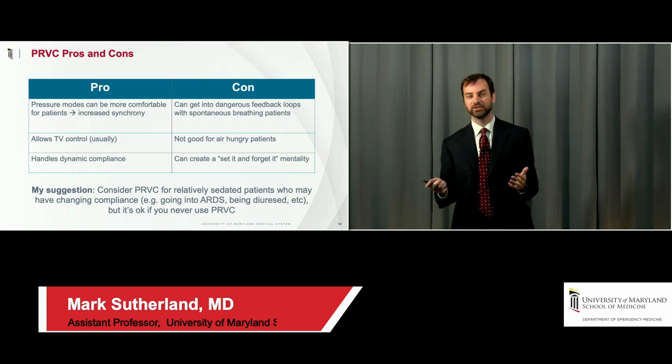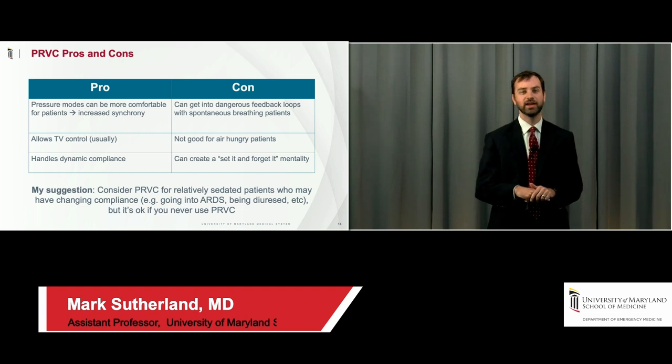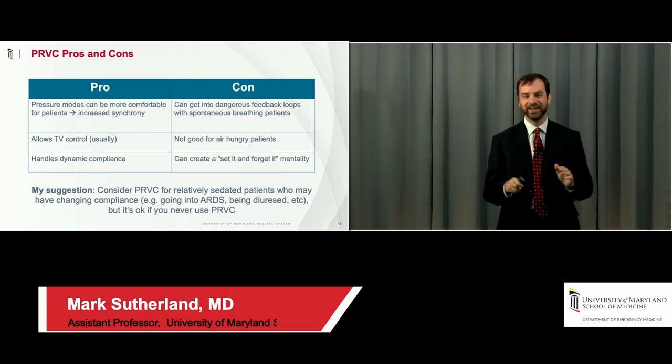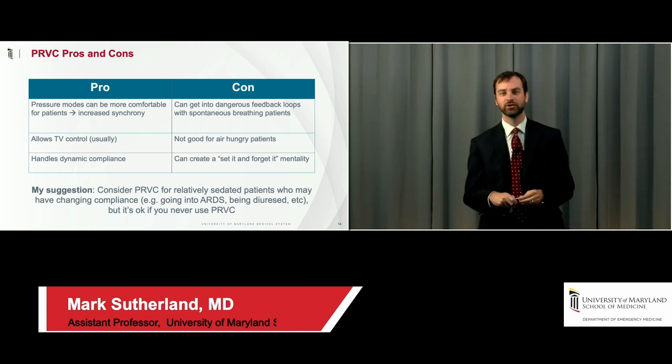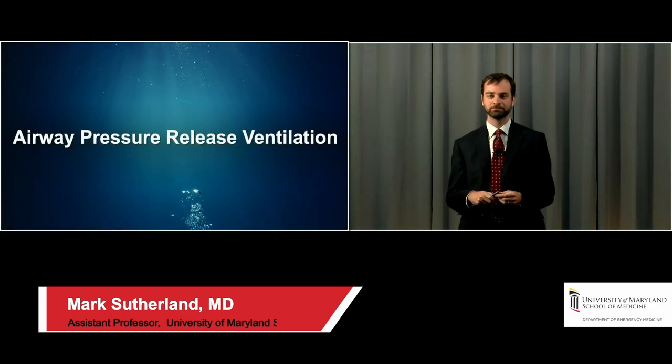But my honest answer is, if you never use PRVC, I think that's perfectly fine. I have yet, in my experience, to have a single patient that I can think of where I've said, I want to put this person on PRVC, I am so excited to do that. I don't think that really happens. So if you get in trouble with PRVC, just switch back to volume control. I think that's a reasonable approach.